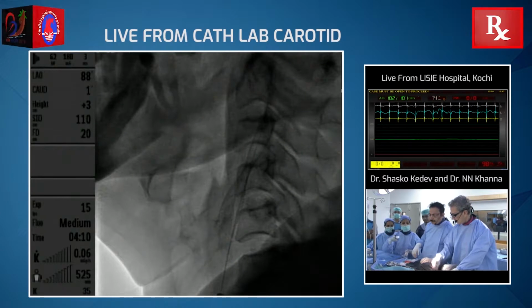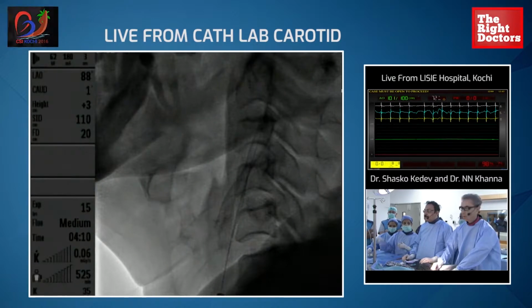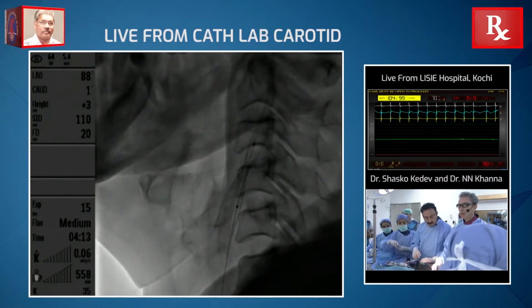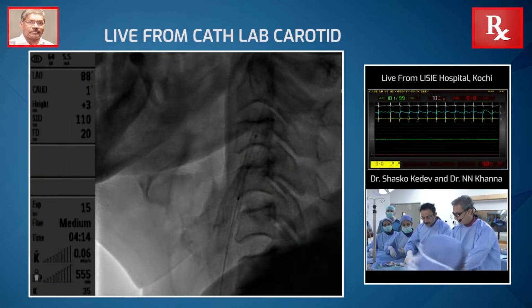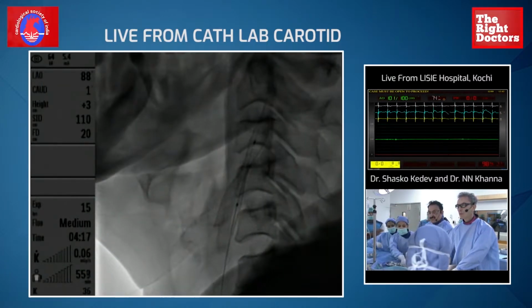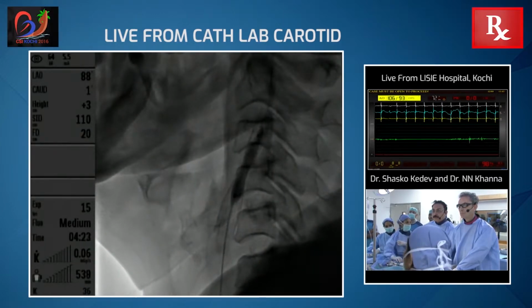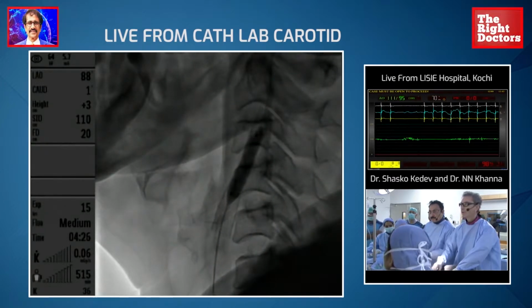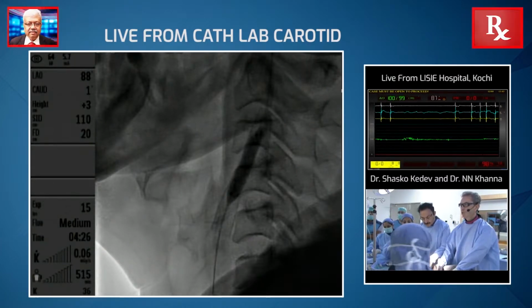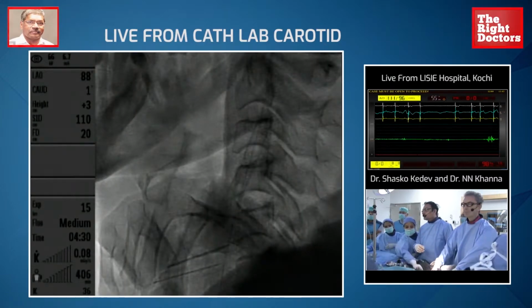You can reduce it. And at this stage we can give atropine. 0.6 of atropine. Because you're holding the wire? Yes, I'm holding. Okay. Now you go. Go. Okay. Negative. At this stage, we also ask the patient to cough, and give atropine. No, she's back to the sinus.